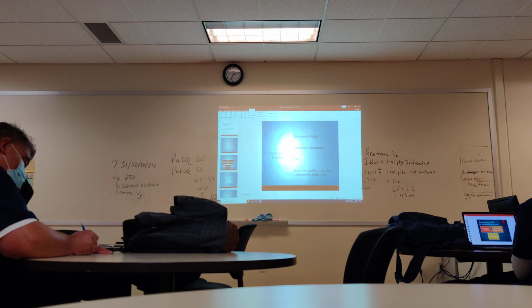So you have to do this part first, and then multiply it by the rate. What'd you get? I don't know if I did my math right, but I got about 8 liters per minute. Yeah, you sure did. You wind up with 8,025, right? So I have to divide it by 1,000.